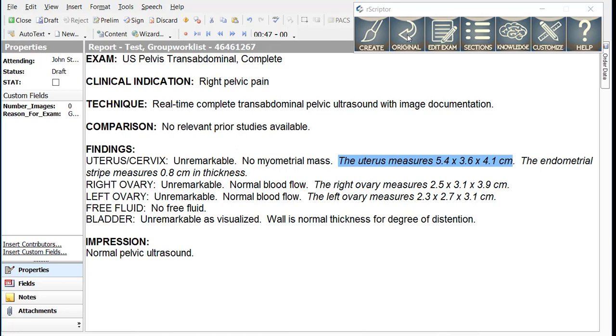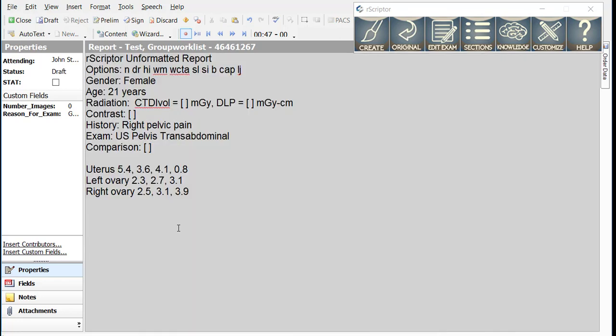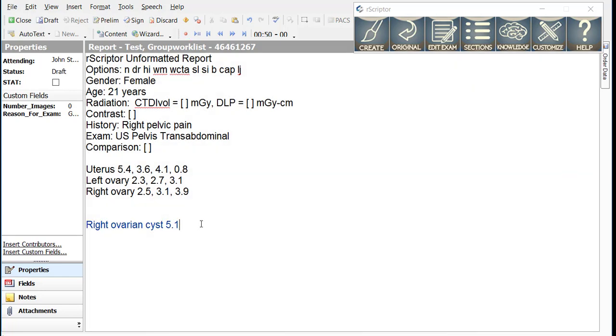Now let's add an abnormal finding. Right ovarian cyst 5.1. So this is the smart macro for an ovarian cyst, a simple ovarian cyst. So we give the side and then we give the dimensions in centimeters. We could give three dimensions if we wish, but I'm just going to give one in this case.